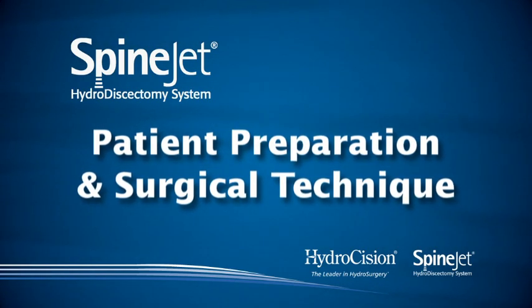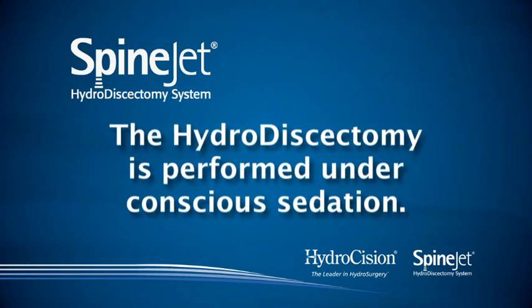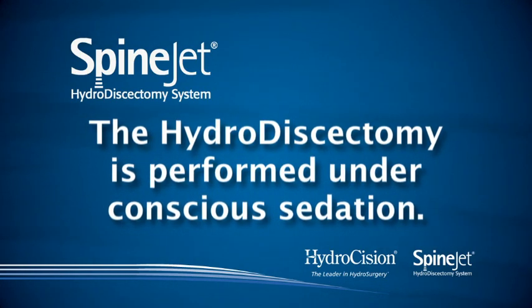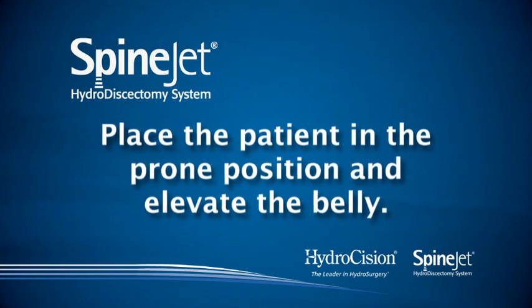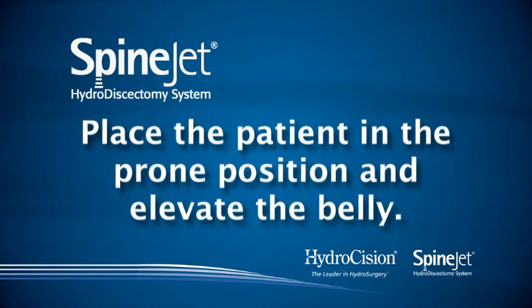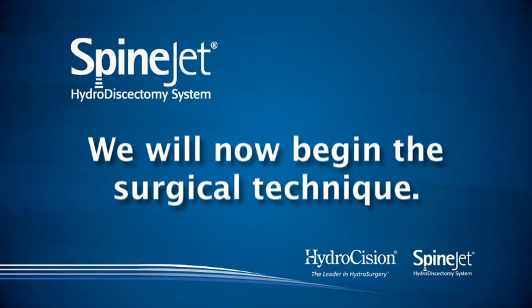The hydrodiscectomy is performed under conscious sedation, which allows the physician to monitor the patient for any signs of nerve root irritation. After the patient has undergone standard preoperative procedures, place them in the prone position, elevating the belly to minimize lumbar lordosis. We will now begin the surgical technique.